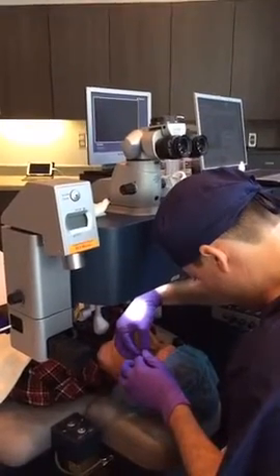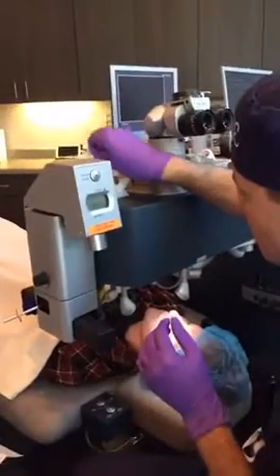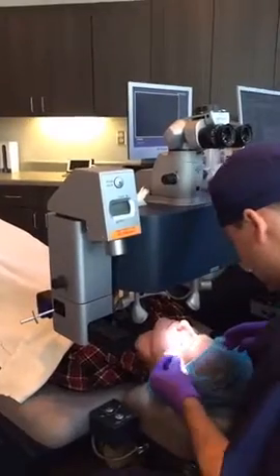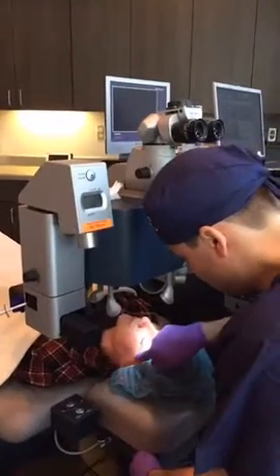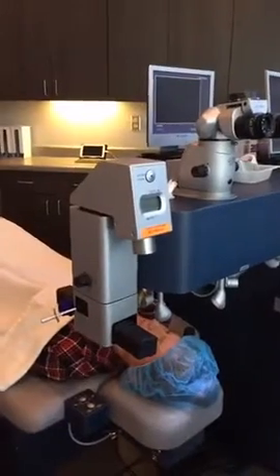And then what we'll do next is bring you out from underneath the laser. Your vision's going to be kind of foggy and hazy, as if your eyes are open underwater. Okay. And that's going to stay that way for the next couple of hours. But every hour it's going to be clearing up more and more throughout the day.